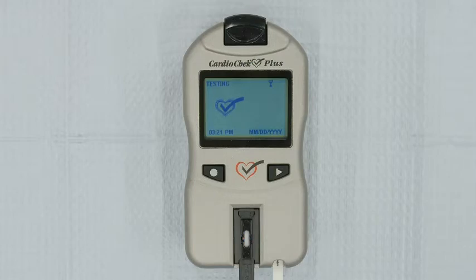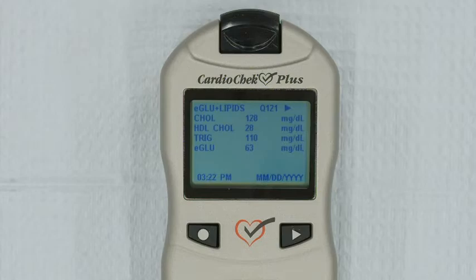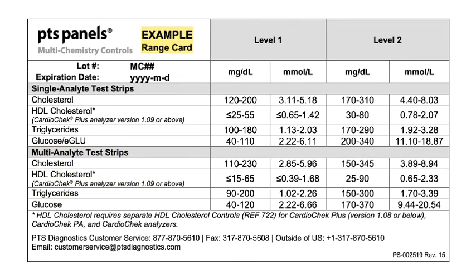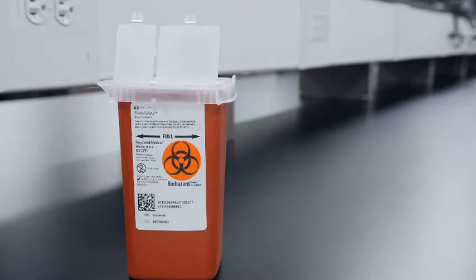The analyzer will automatically begin testing and will return results in as little as 90 seconds. Do not move the analyzer while it is testing. Once the results appear, check your range card to see if your results are within the specified range. Look under the header single analyte test strips on the card for the glucose range. Look under the header multi-analyte test strips on the card for cholesterol, HDL cholesterol, and triglycerides ranges. Record your results, remove the test strips, and discard them in a biohazard container.